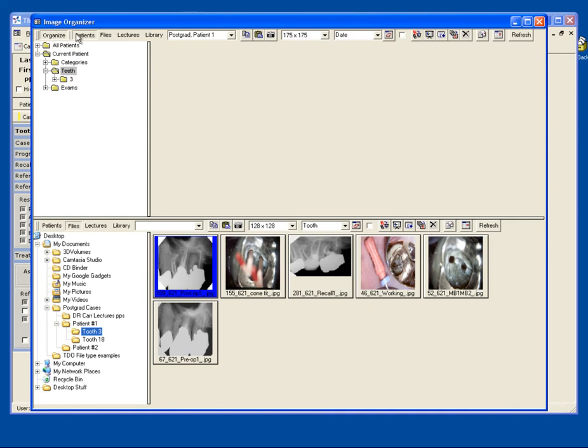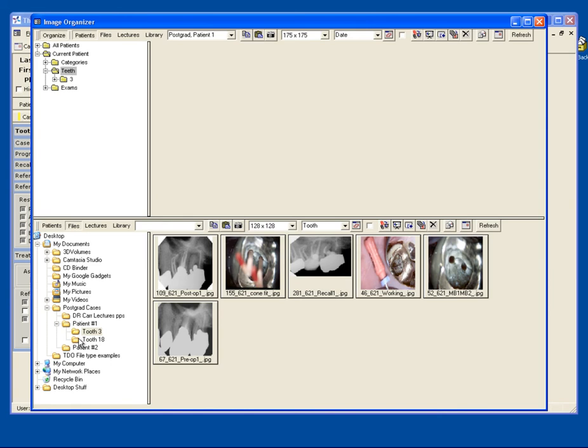The top section, I like having patients selected, so you will see the pictures for this particular patient. And on the bottom section, you would like to click files, and that way you can browse through your computer and any drives to find the pictures that you're looking for.